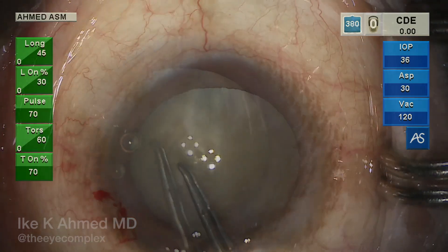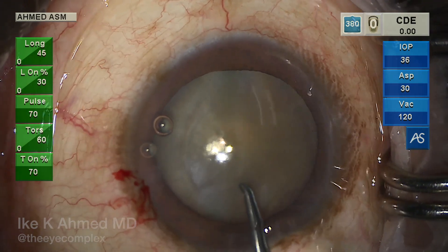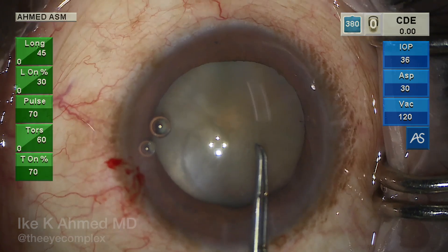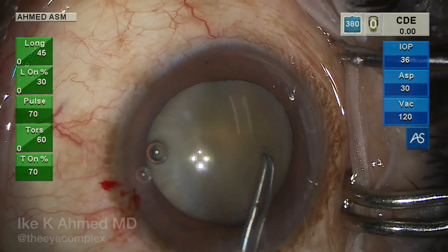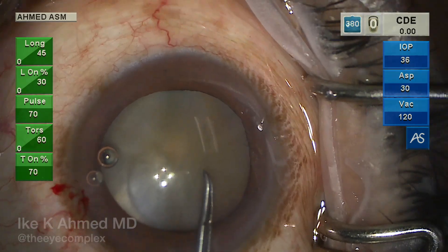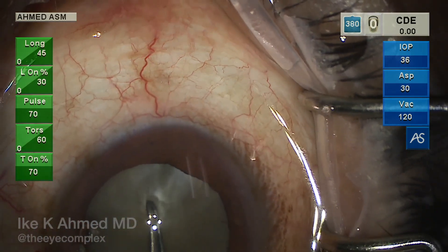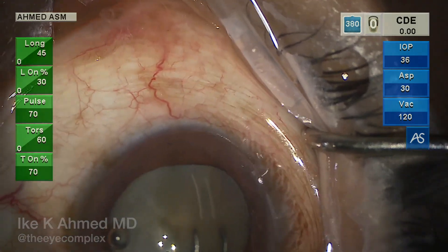This is a patient with about three diopters of against-the-rule astigmatism and a somewhat dense cataract. The capsulorhexis starts off reasonably well, but as the surgeon propagates the tear inferiorly, the rhexis runs out. We see it at the pupil margin, and the surgeon unfortunately fails to bring the rhexis in. Insufficient vector forces are used, and the rhexis continues to propagate out — now under the iris, quite far into the periphery, probably at the equator near the zonular insertion.